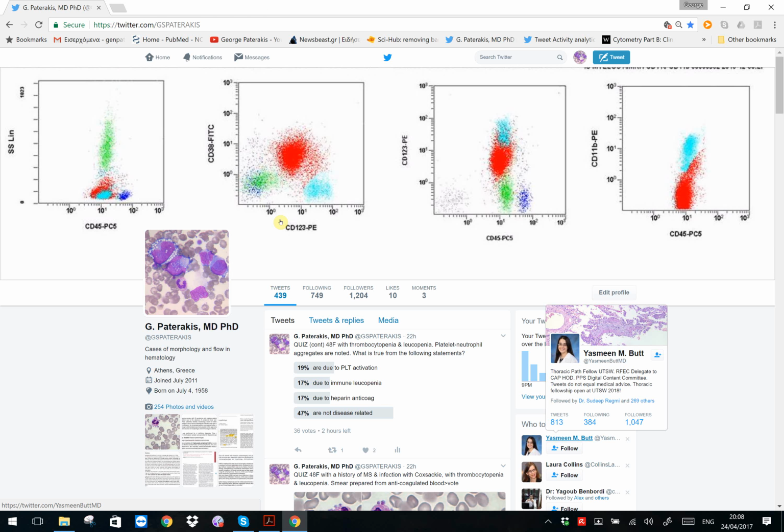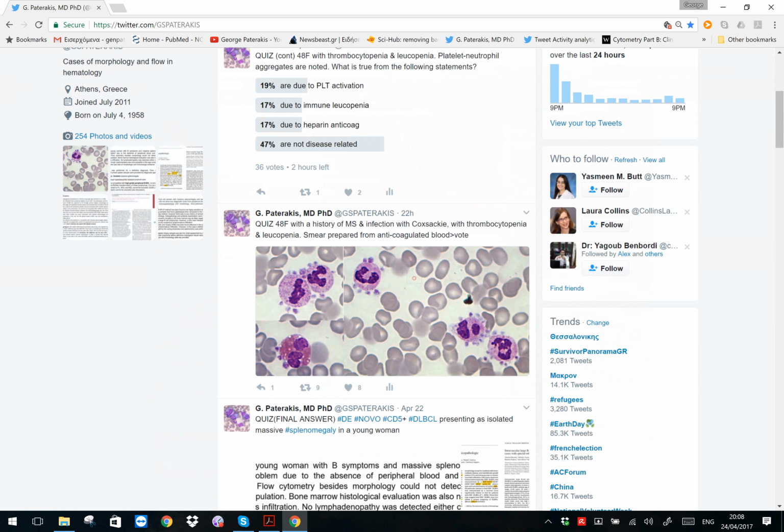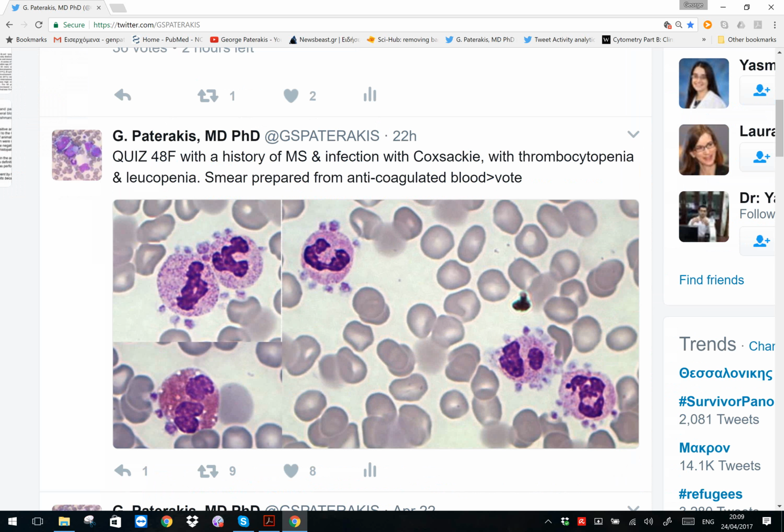So hello from Cases of Morphology and Flow in Hematology. What do we have here? We have a recent quiz presenting a woman's multiple sclerosis history with this smear of her blood, anticoagulated with EDTA. This woman had an infection, and the infection was attributed to Coxsackie. So thrombocytopenia and leukopenia were correlated with the infection.